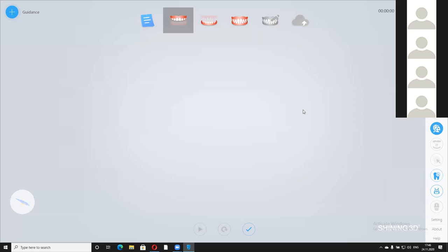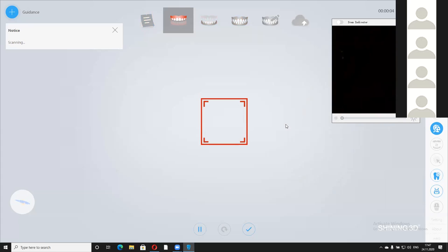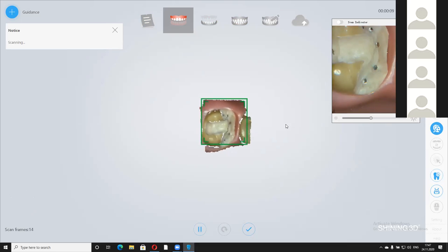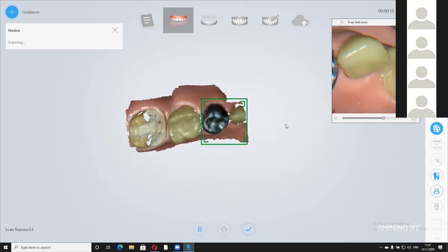So now I've got the model here. And what I've got on this model is, I just made a model which has got a metal tooth on it also, so you can see this and even scan an implant afterwards. So the first thing which you would do is you would pick up the scanner, like you see here. And automatically on the screen, you see this square coming and you see this thing here, okay? So the scanner basically, and you go left and right, okay? So you see.